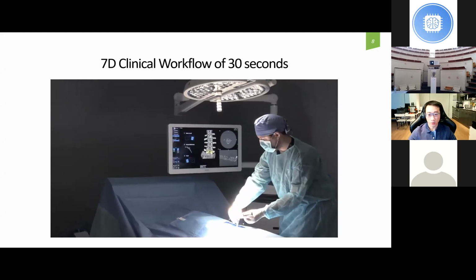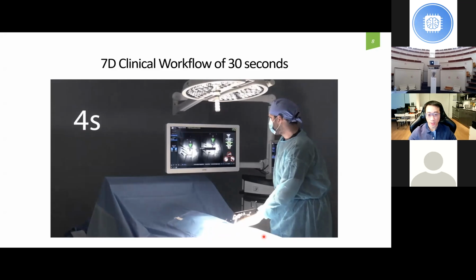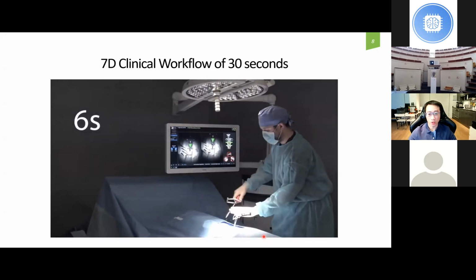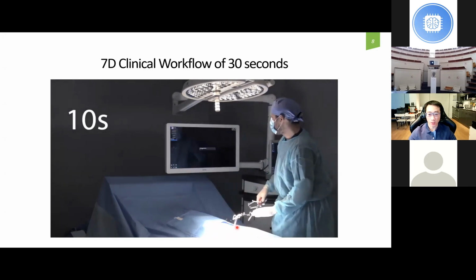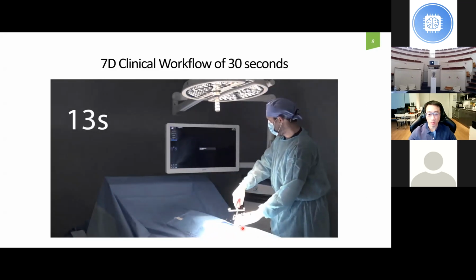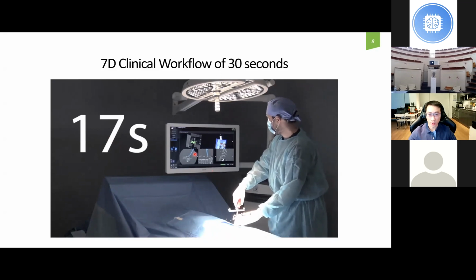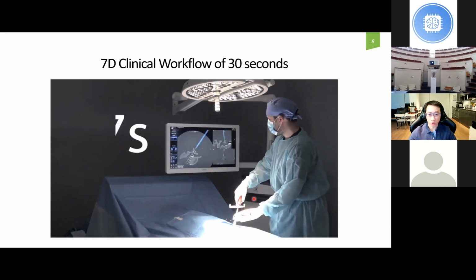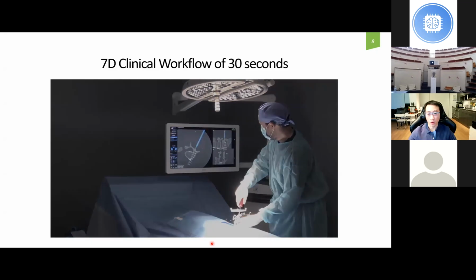So this is the surgical workflow. When the foot pedal is pressed, there's a flash of light that is used to digitize the patient. Here you see a 3D image of the patient as the system sees it in the operating room. We've loaded a preoperative CT, and in about 30 seconds or so, we're navigating. The blue is a tool that the surgeon is holding. It's tracked in real time, showing you where the tool is relative to the bone or the spine.